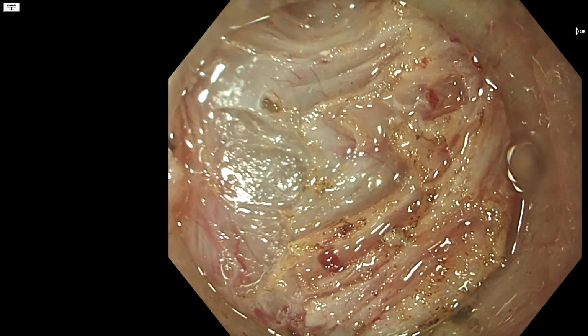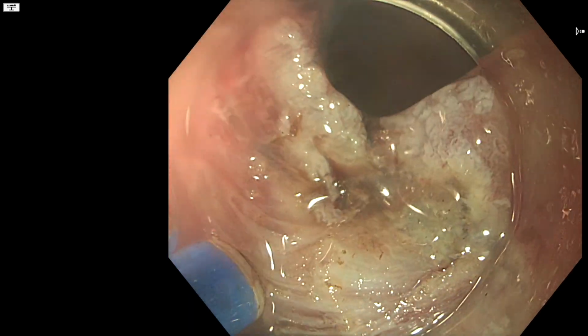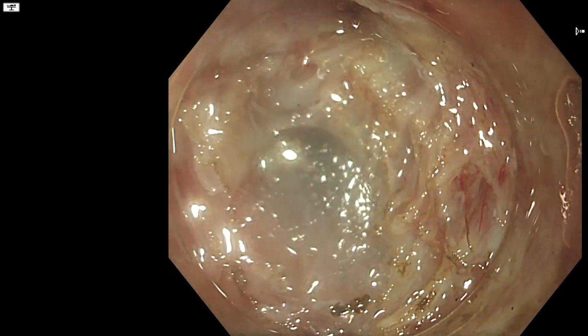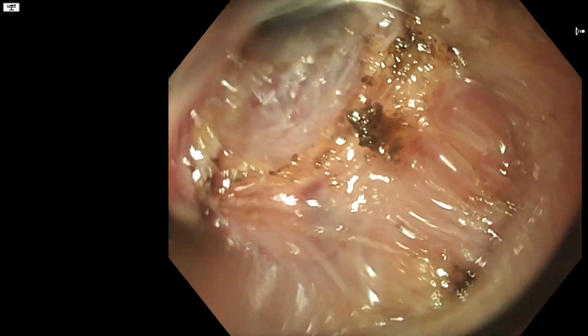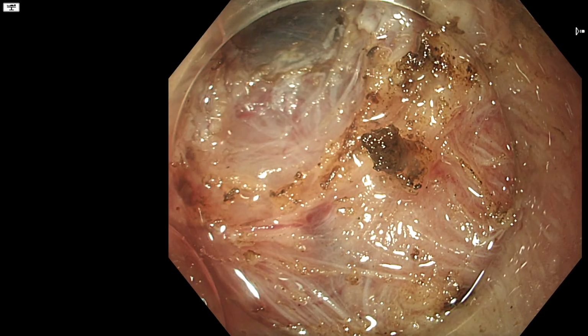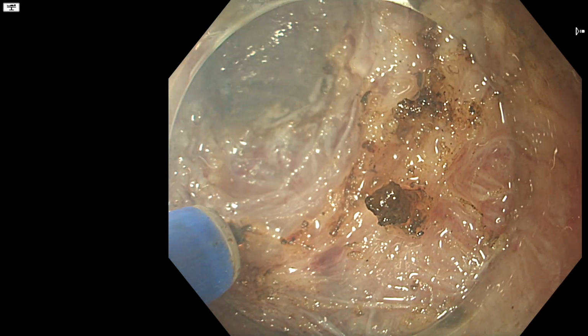One advantage of the intermuscular plane is that it's relatively avascular. There aren't really that many bleeding vessels here. What you do have are the larger penetrating vessels that can then branch into the submucosa, but if you identify those and avoid them, then you can usually cut safely with a cutting current.